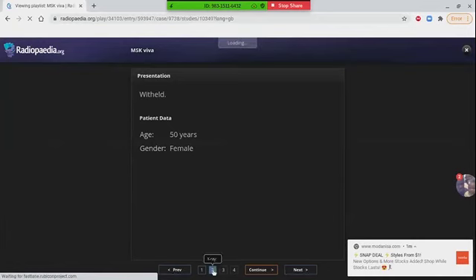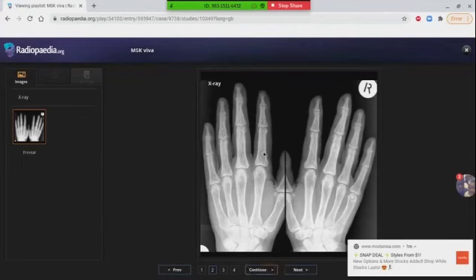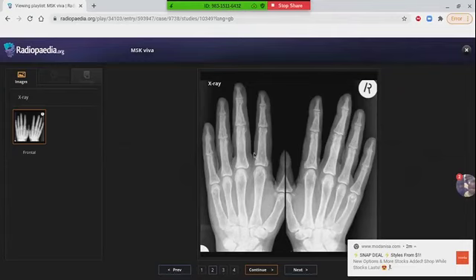The hand X-ray with acro-osteolysis and subperiosteal resorption — when you see this as the only image, you should think first of primary hyperparathyroidism, because whatever diagnosis you give, you should be able to manage it. Separate primary from secondary: if primary, suggest imaging of the neck to look for a parathyroid adenoma. Look for renal issues to rule out secondary hyperparathyroidism and correlate with serum markers. Imaging of the neck can include ultrasound or sestamibi scan.